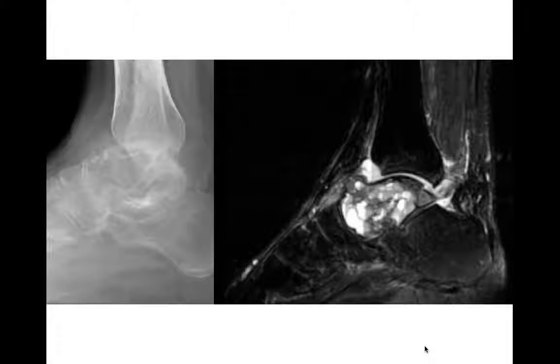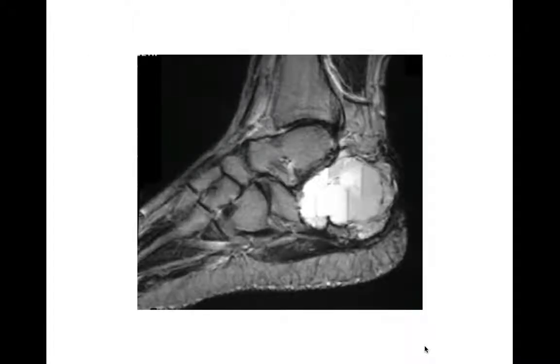For your differential diagnosis of fluid-fluid levels, giant cell tumor is on that list. Could this be an aneurysmal bone cyst? Sure — you can have ABC here too, so you may be stuck between those two differentials. This one turned out to be a giant cell tumor. Remember: your differential for fluid-fluid levels on MR includes giant cell tumors, aneurysmal bone cysts, chondroblastomas, and telangiectatic osteosarcoma. This is another example of a giant cell tumor occurring in the posterior calcaneus.